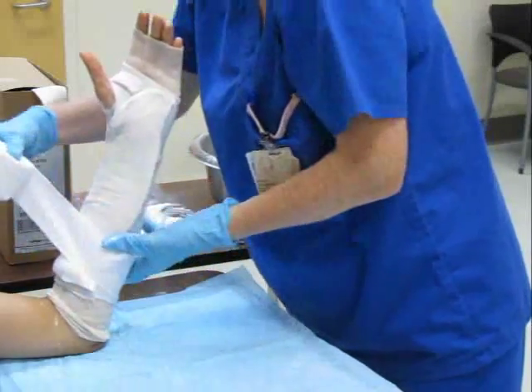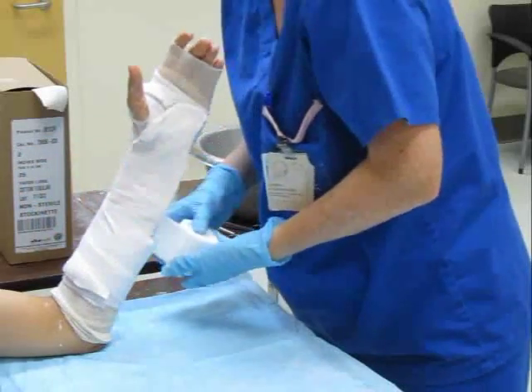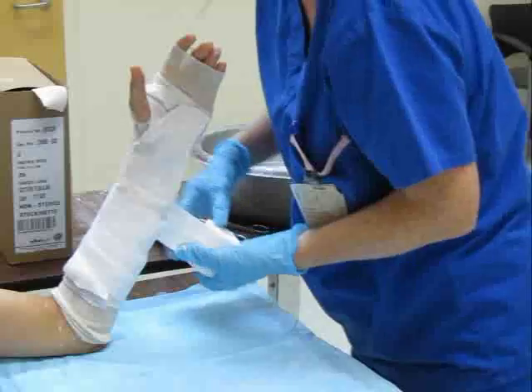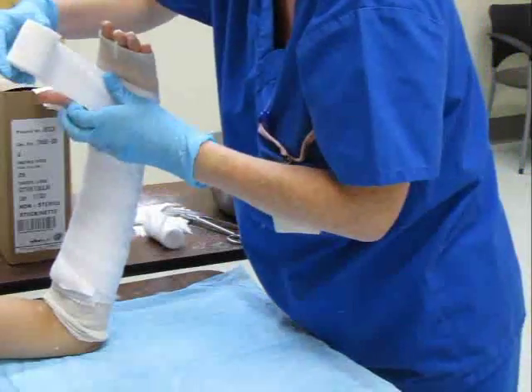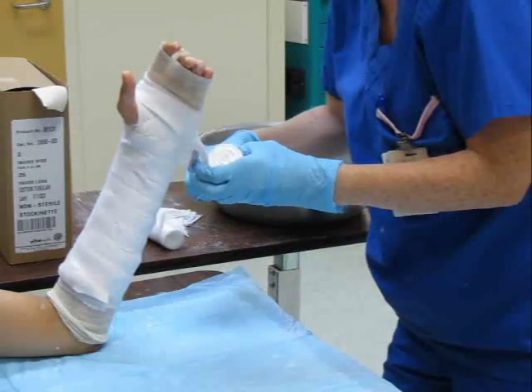Overwrap the plaster slabs with flannel from proximal to distal, overlapping by approximately 50%. Tension the flannel appropriately to prevent bunching, but avoiding excessive compression of the forearm. Wrap the wrist and hand, pinching through the first webspace. Trim any excess material.